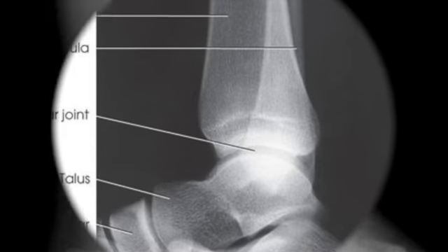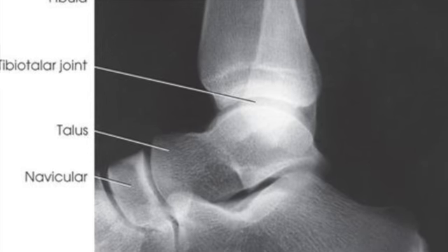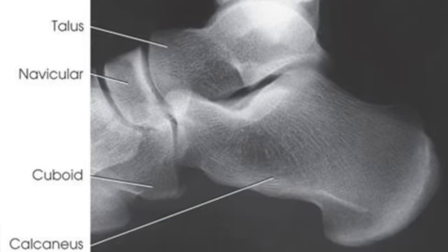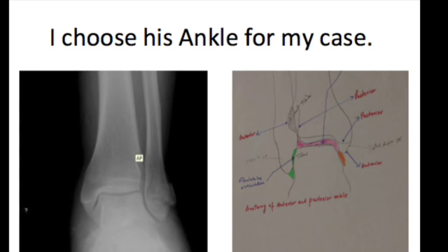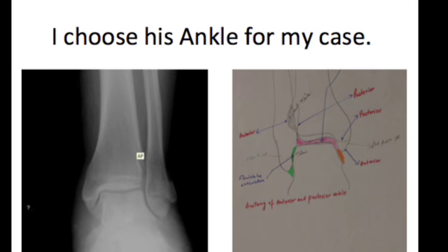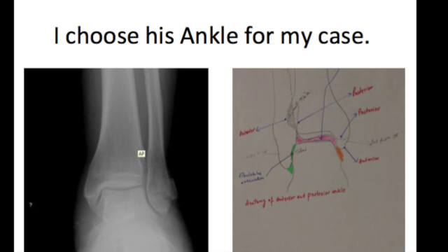A 55-year-old male patient came to the X-ray department with the help of a cane. He has pain in his ankle due to a fall in January 2017. This was his third follow-up. He fell down on the train track and hurt his left ankle. His ankle was swollen and has had on and off pain for about 4 months.